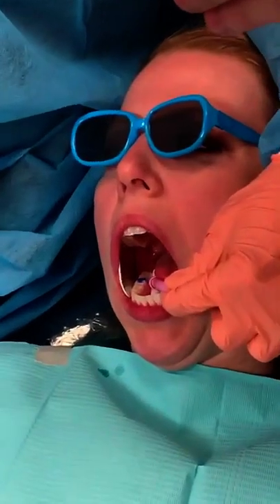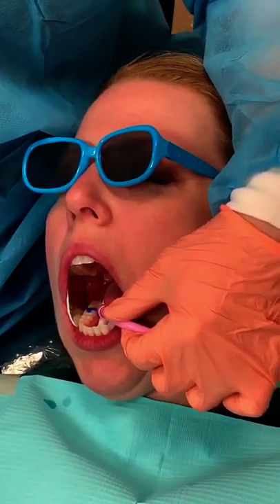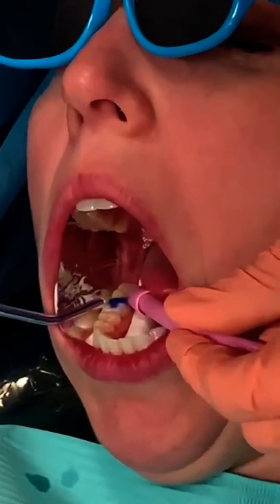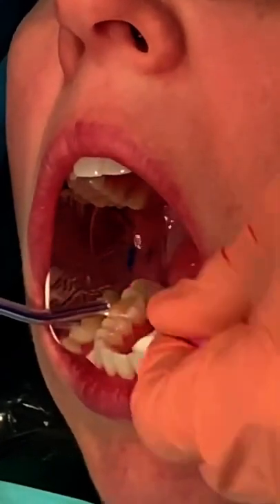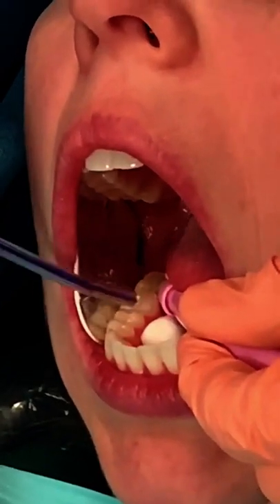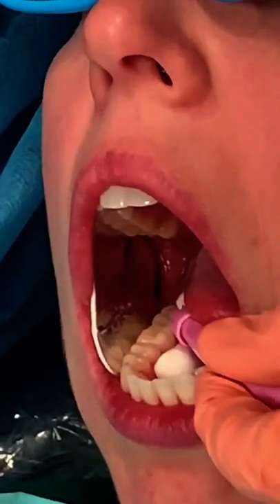I'm going to spray the water across the tooth into the suction. I use the low speed because I just don't feel comfortable with the high speed in the mouth. I come out here and blow the air off to get all the air out of the line. And then I'm going to dry this off until it looks chalky.